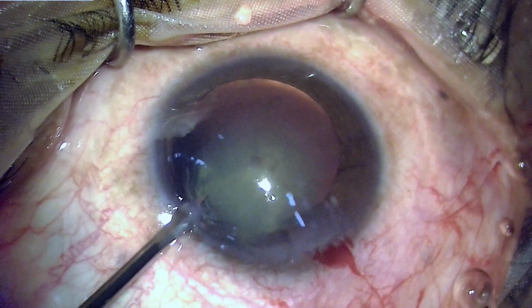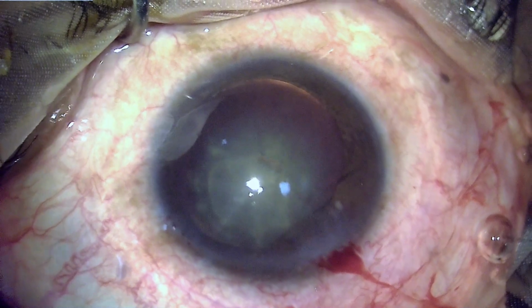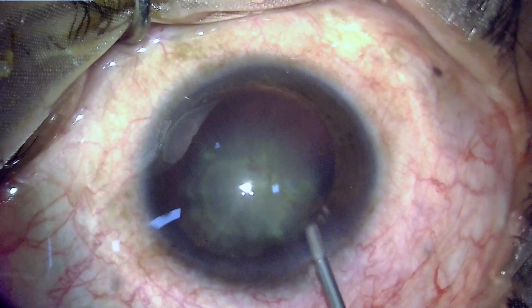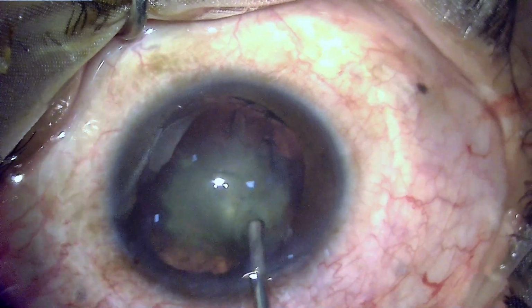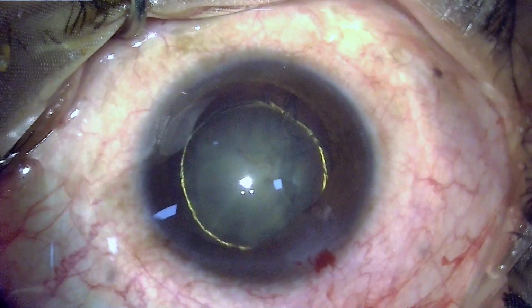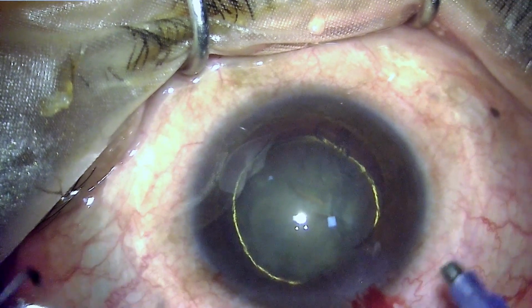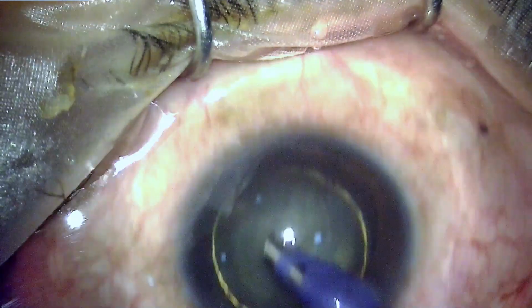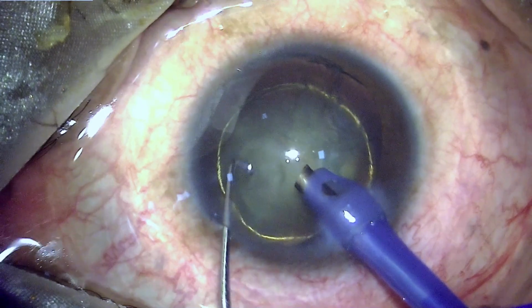The most unique problem in these eyes is that the oil has a tendency to prolapse up. Being in an environment where there's water and oil, the oil being lighter is always buoyant and it has a tendency to move towards the anterior chamber, and this poses a problem the moment you have an opening which can allow the access of the oil bubble into the anterior chamber. And if there is a pressure difference which is significant, then the oil can actually seep through the zonules also.